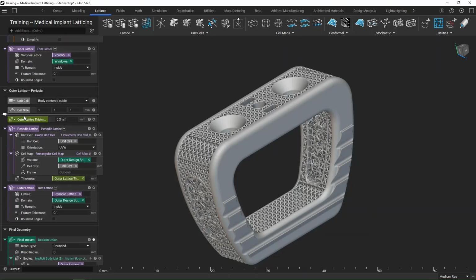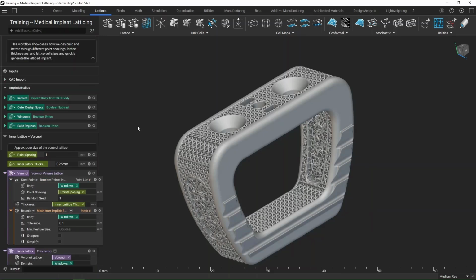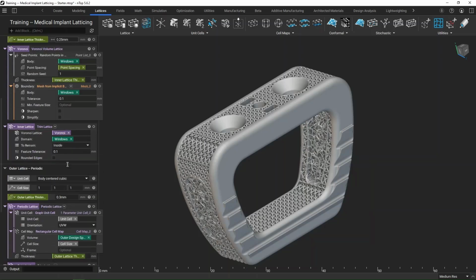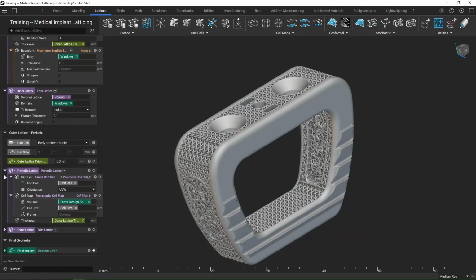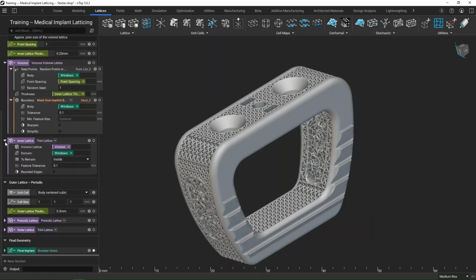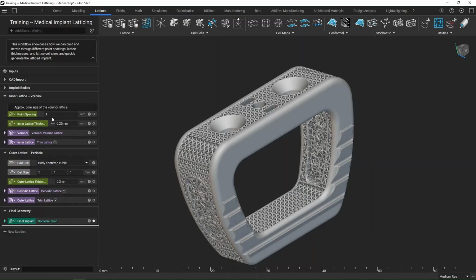We've already called out some of these inputs. And so what we can actually do is very quickly turn this into a custom block. Maybe you've done this before. Maybe you haven't played with custom blocks before. But it's very simple and easy to do. So what I'm going to do, because I have my notebook kind of nice and organized already, maybe I'll even close these up to keep things nice and tidy. You can see how simple everything looks.